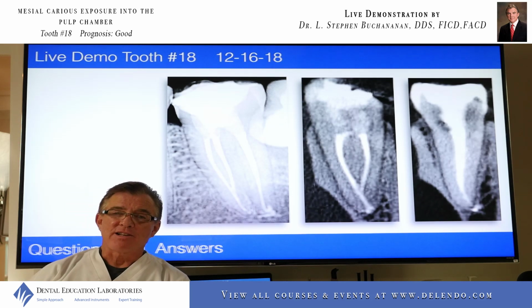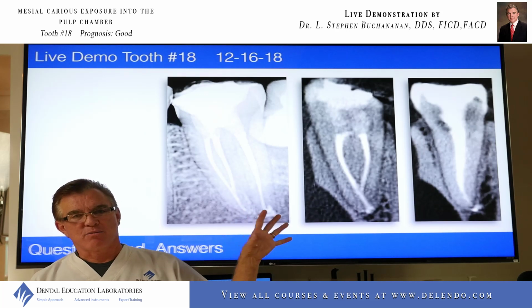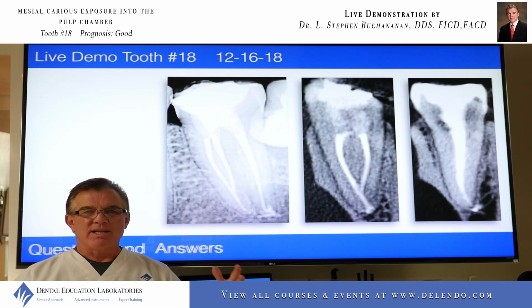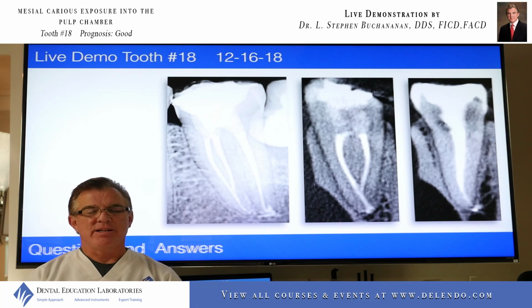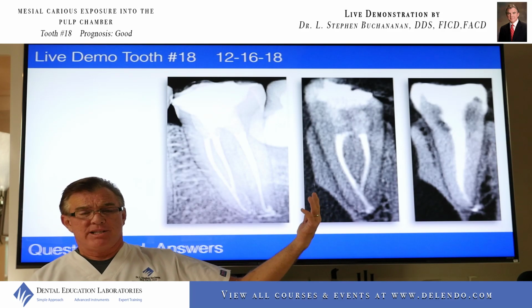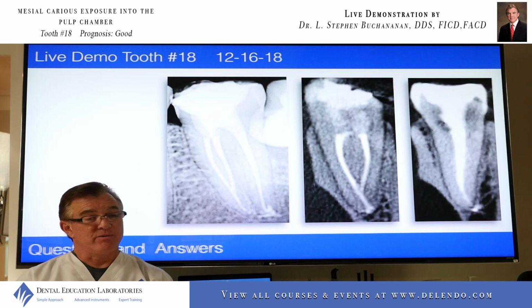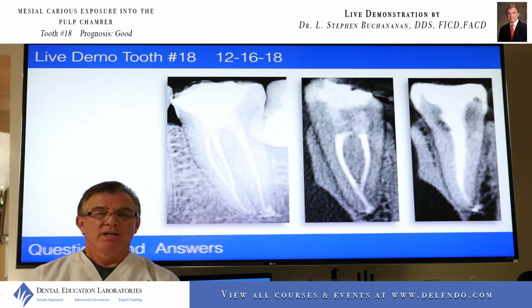One of my assistants actually thought that after the cone beam CT machine stopped running in the room we used to have it in, there was residual radiation in there that had to die down over a period of time. We were able to put a radiation sensor in there and show her that 4 feet away from the CT machine there was no radiation even while it was operating. And that's generally true of CT machines as well. That ends the questions for this case.